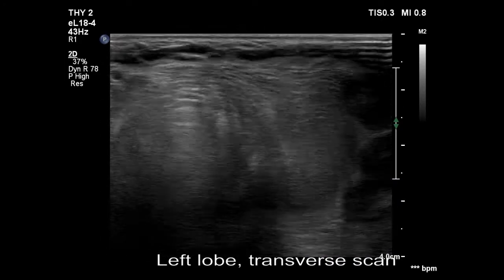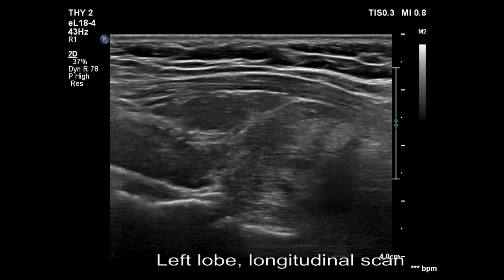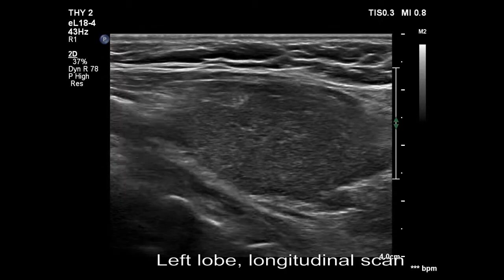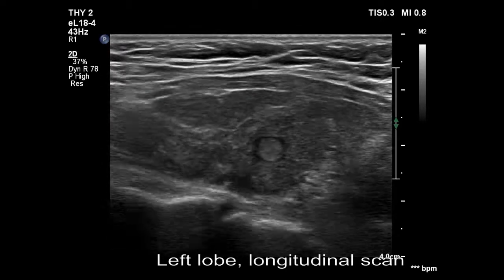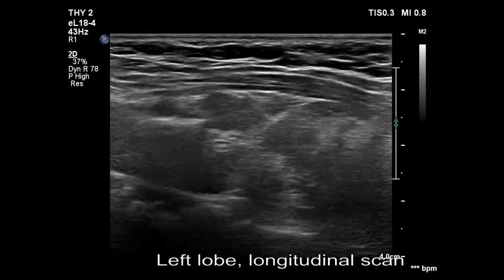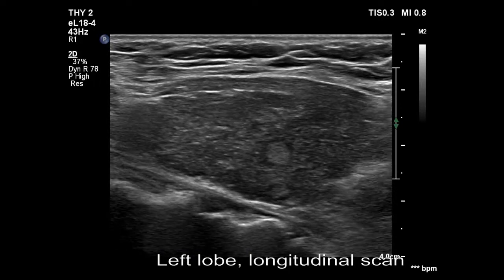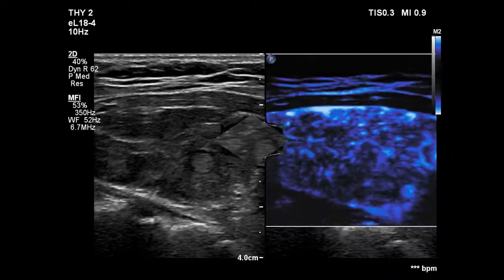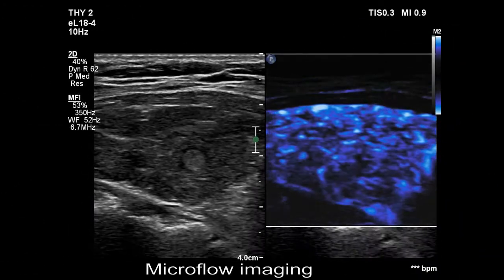The left lobe has a similar pattern, but there is a small isoechoic discrete lesion in the central part. The vascularity is a bit increased.